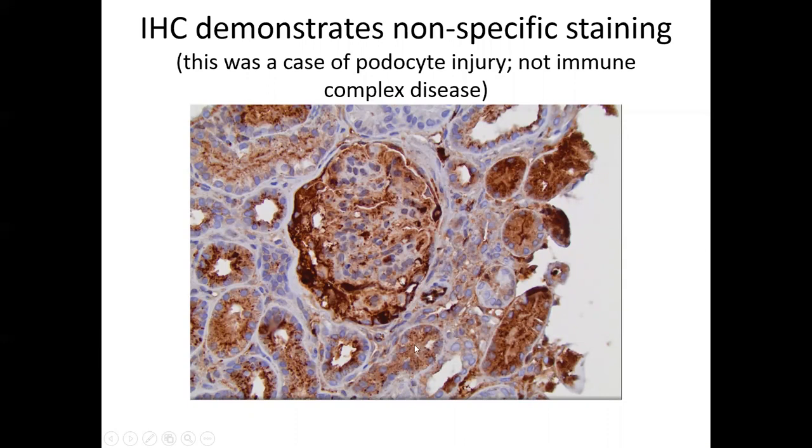We're still trying to tweak this to see if we can get a better granular staining pattern, because it would be wonderful if we didn't have to use fresh frozen OCT embedded specimens. But I can tell you, we've tried multiple different preparations, multiple different types of incubations, and multiple types of antibodies, and none of them have seemed to be working. And in human medicine, they don't trust this, they only trust the IF. Unless you're from Europe, apparently they trust it in Europe.